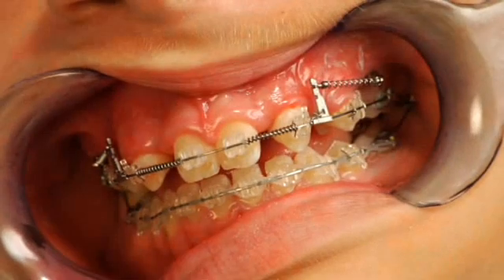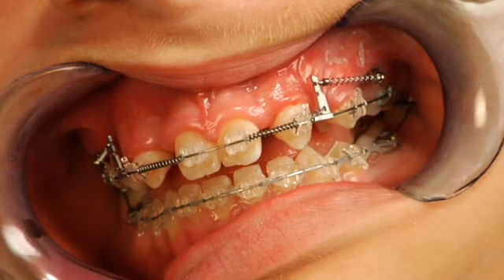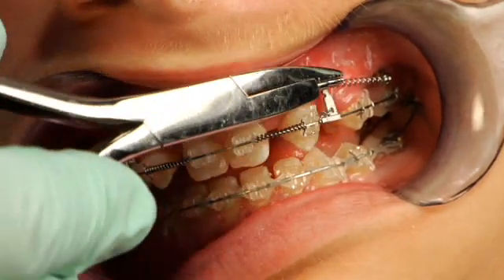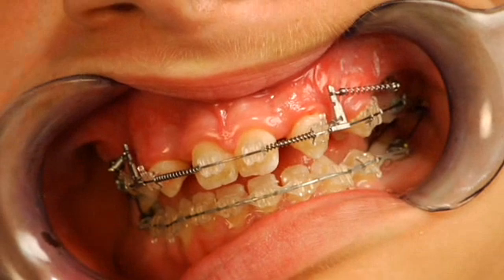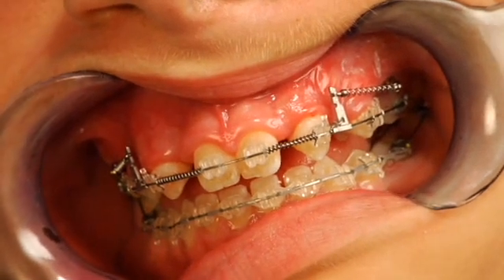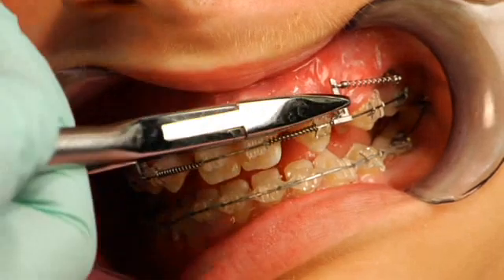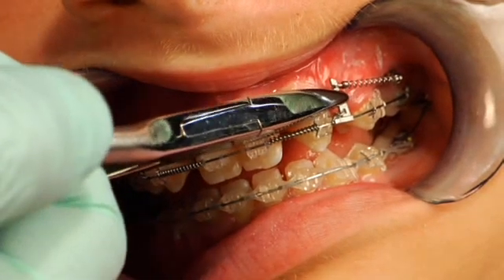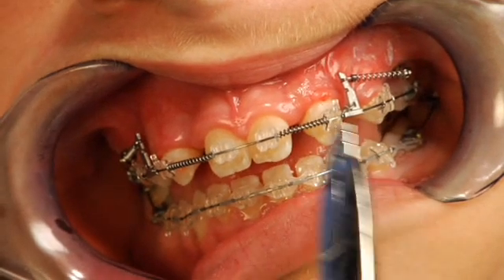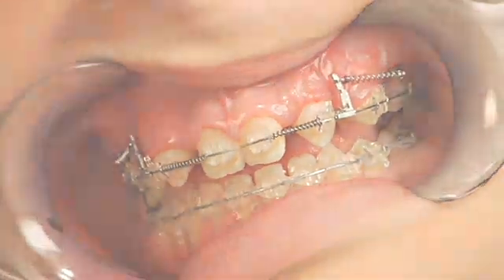One really neat thing about the system posts is that they're flat, giving a nice smooth contour to the cheeks and lips. They also have the ability to be contoured — so if we want to slightly bring the post in, we can go in with a tweed loop plier and bring the posts in tighter to the tissue.